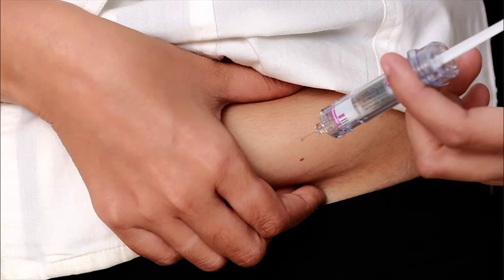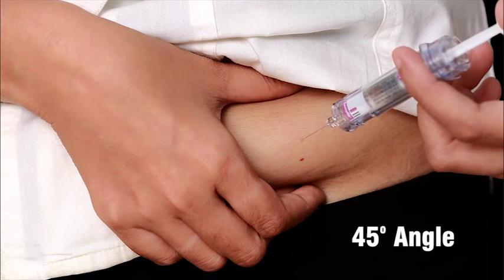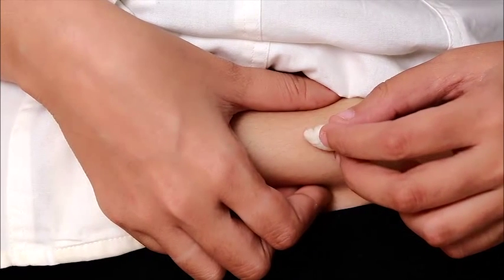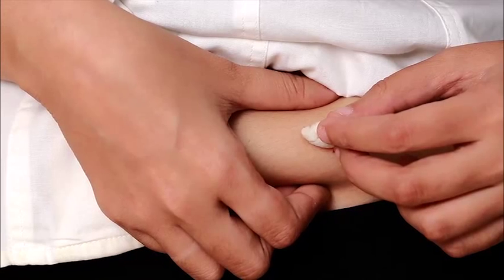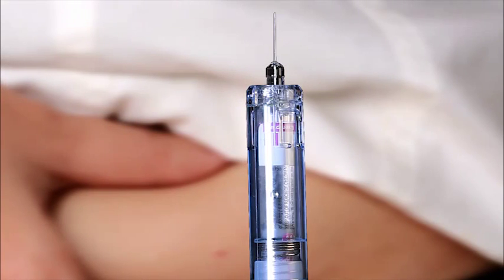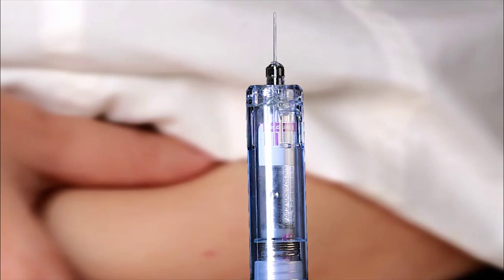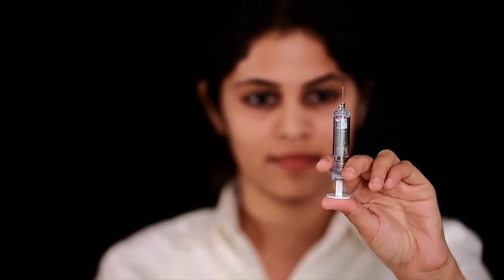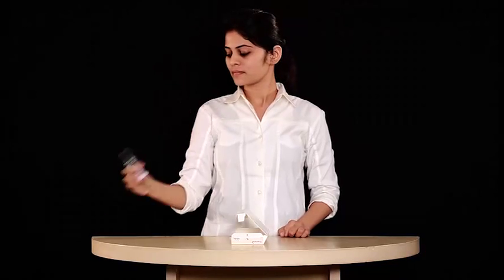After the needle is in, inject the drug. Pull the needle out. Press a cotton ball or gauze pad over the injection site and hold it for 10 seconds. Orient the needle away from you and others. Activate the needle preventer by firmly pushing the plunger rod until you hear an audible click. Immediately dispose of the syringe safely.